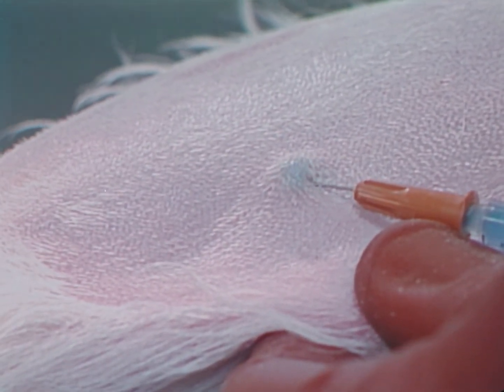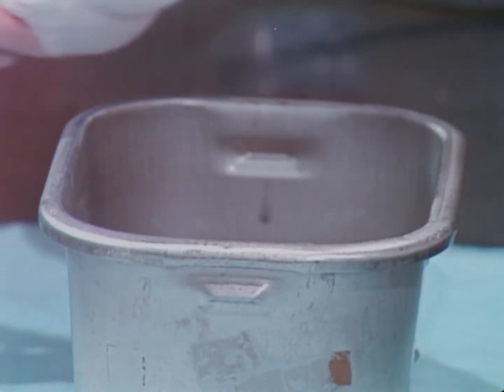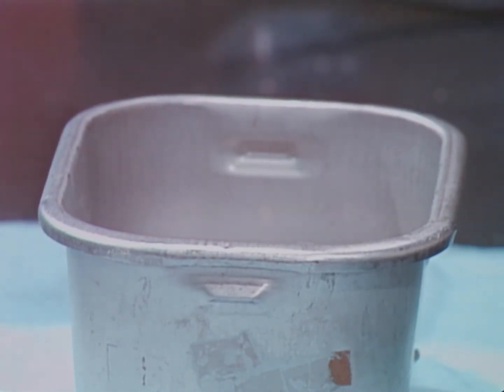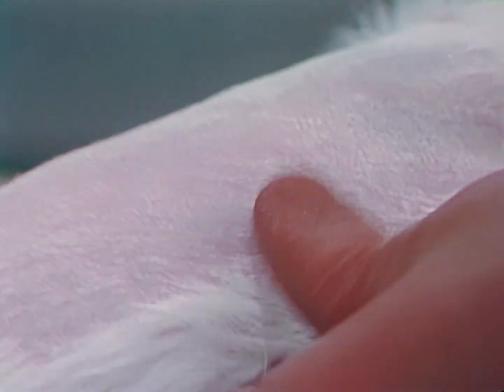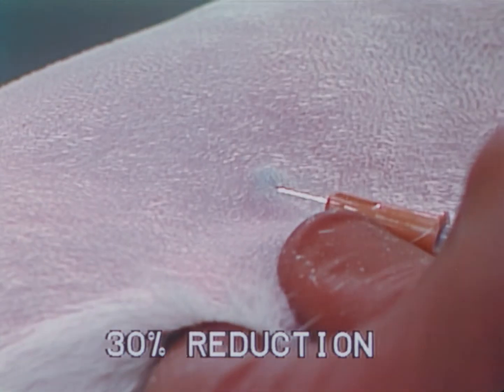When animals are inoculated, a portion of the inoculum often leaks back onto the animal's skin. When the animal is returned to its cage, organisms on the skin contaminate bedding. These organisms may then be carried throughout the room on air currents. Swabbing the injection site with antiseptic both before and after injection will reduce airborne organisms by 30%.